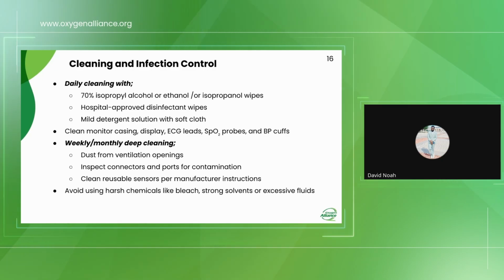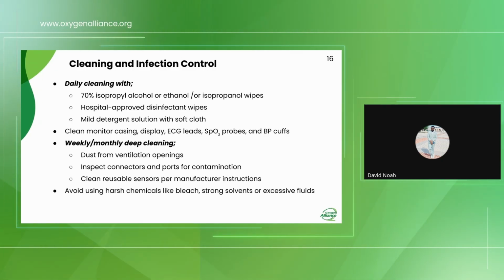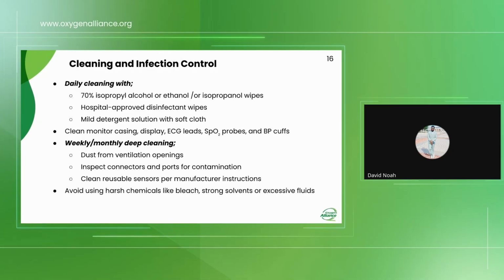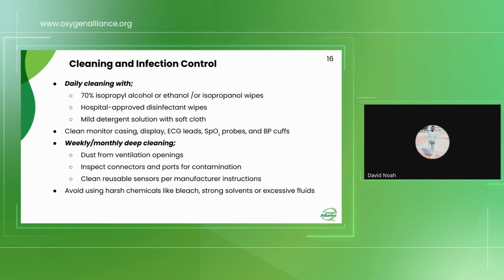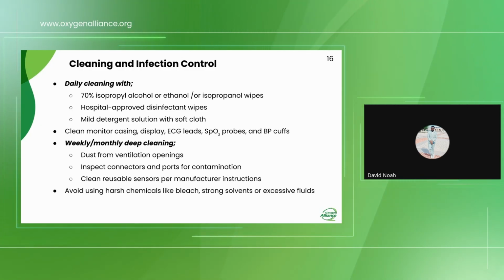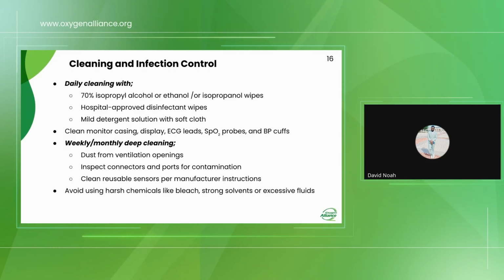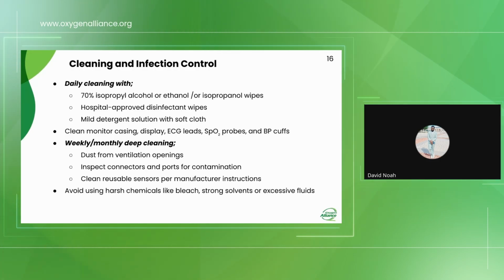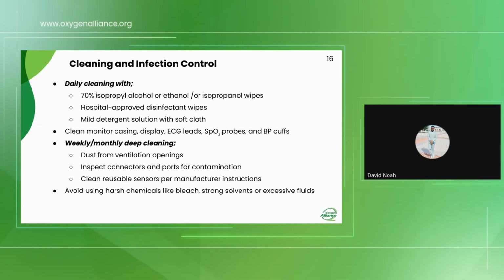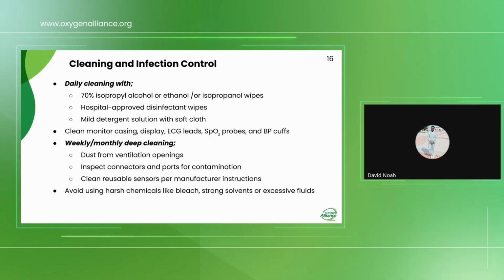During cleaning, some of the precautions that have to be followed include not using harsh chemicals like bleach or strong solvents, because these chemicals might end up damaging the plastic casing of your patient monitor. And also make sure that excessive fluids are not allowed to enter the connectors or the ventilation openings, as this might cause short circuits inside the patient monitor.